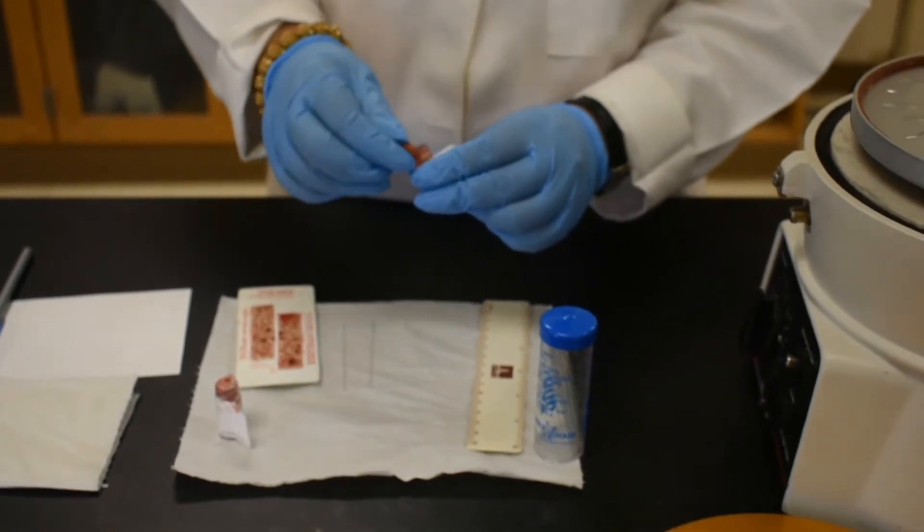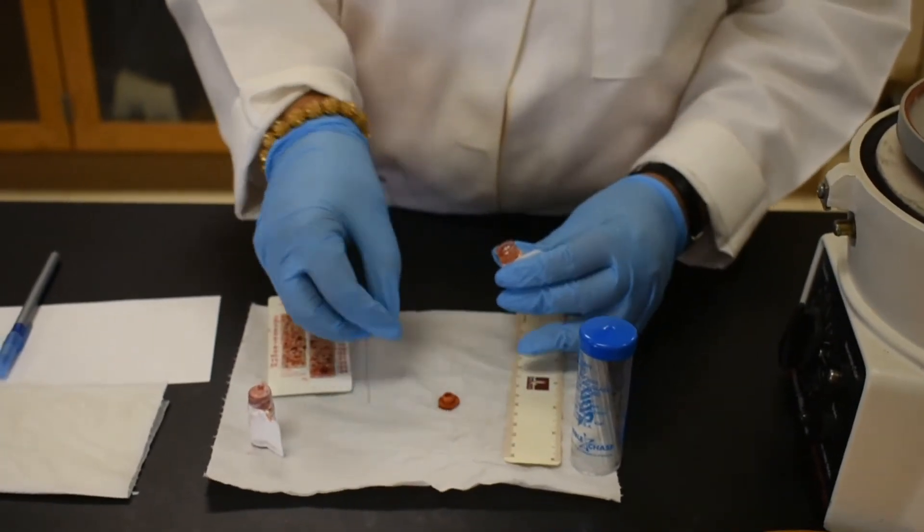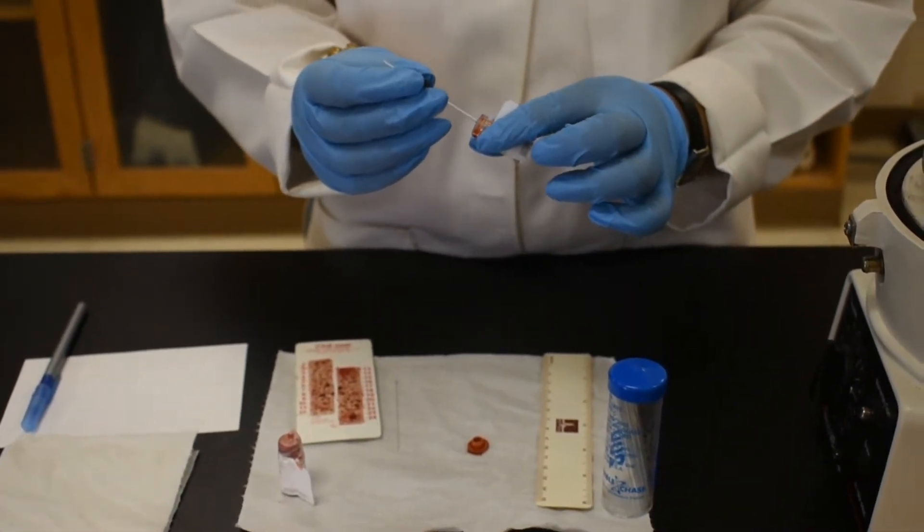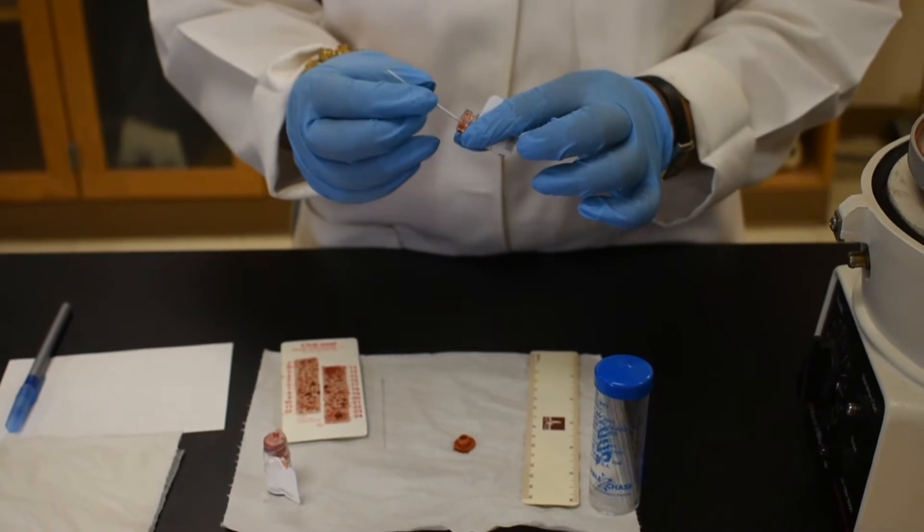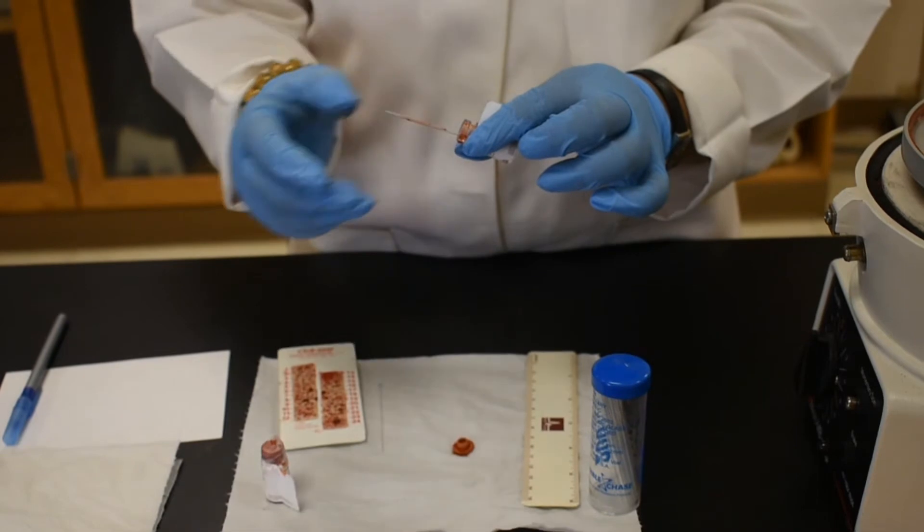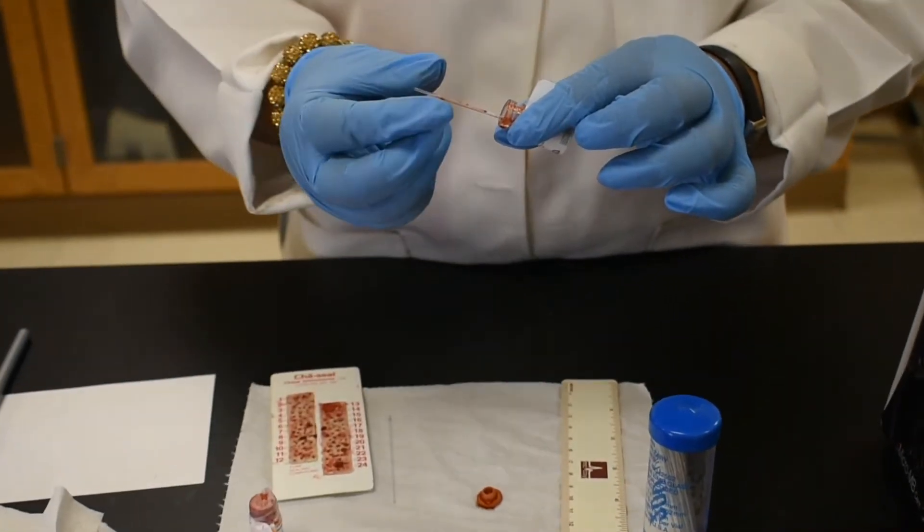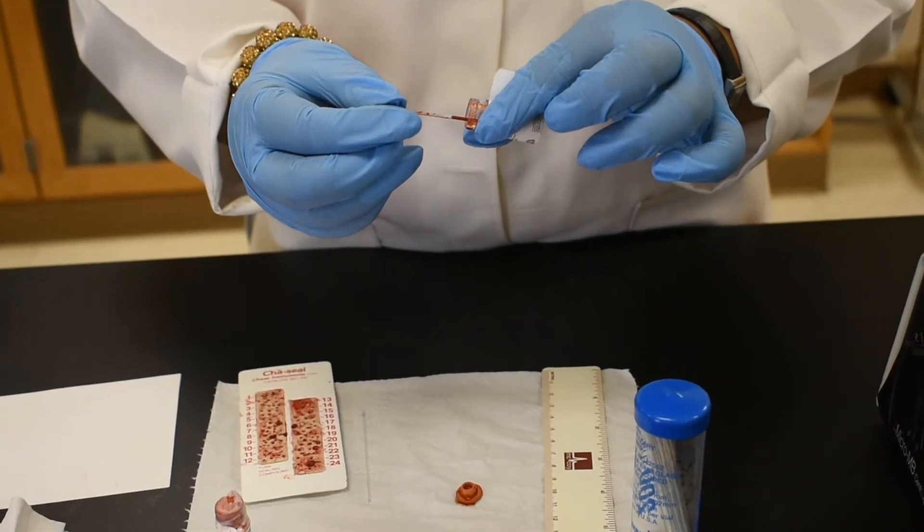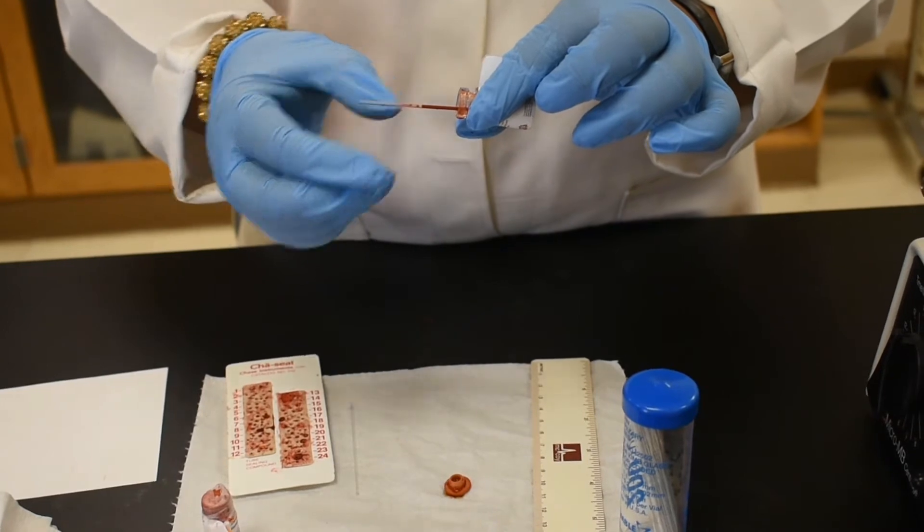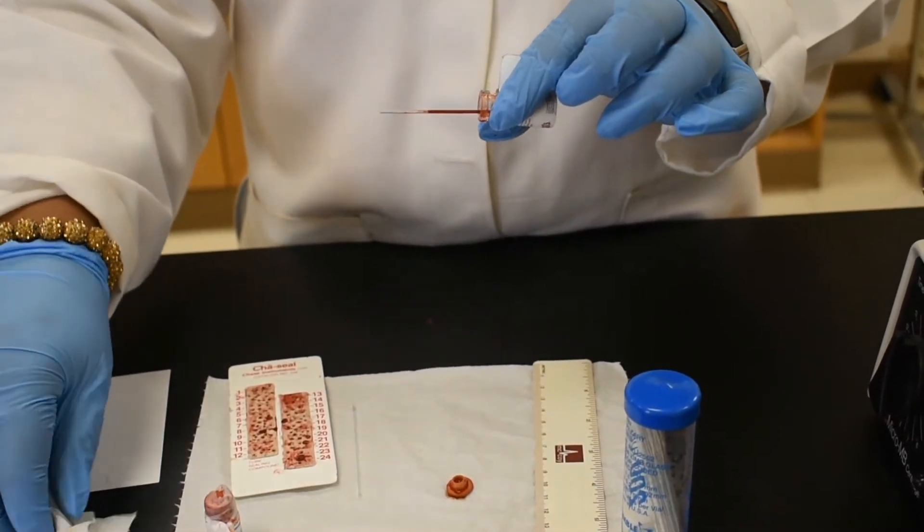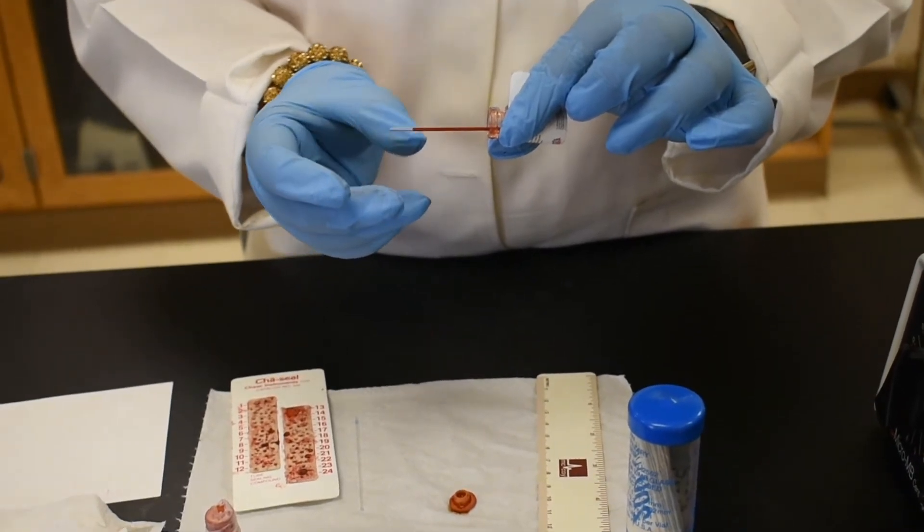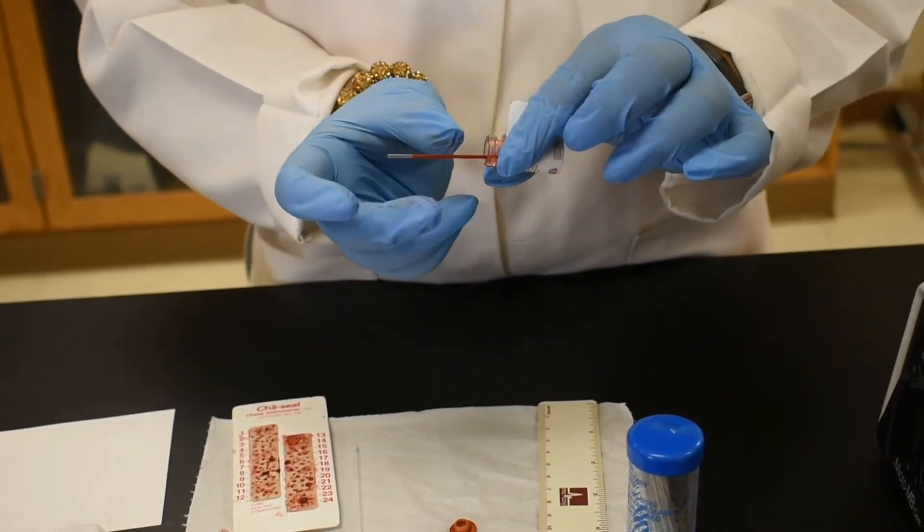Now we will draw the blood in the tube. The vial should be slightly tilted. And then you will see the blood will start coming through the capillary tube. This is called capillary action. We will go up to three-fourths. We will leave about half an inch from the top and stop.